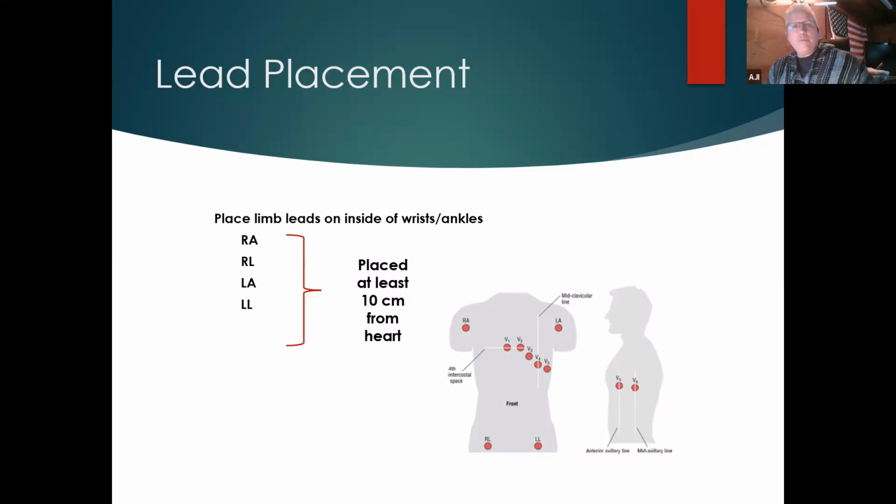That's okay. You'll also find people that will place the limb leads on the lower abdomen right above the hip. I'm not a huge fan of that because there's potential for a skewed representation of an EKG if you do that. Is it wrong? Not for me to say. That's for the cardiologists that argue over millimeters on an EKG. So how do I do it? I do it this way, how they're talking about it.